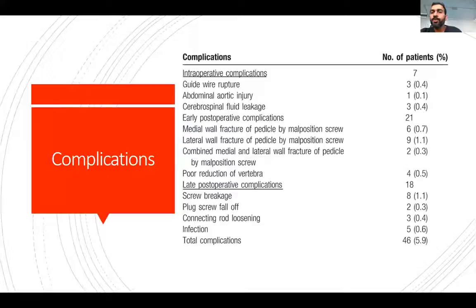The early post-operative complications are the medial or lateral wall fracture of the pedicle by malpositioning of the screw, or combined medial and lateral wall fracture, or poor reduction of the vertebra. Late post-operative complications are screw breakage, plug screw fall off, connecting rod loosening, and infection.